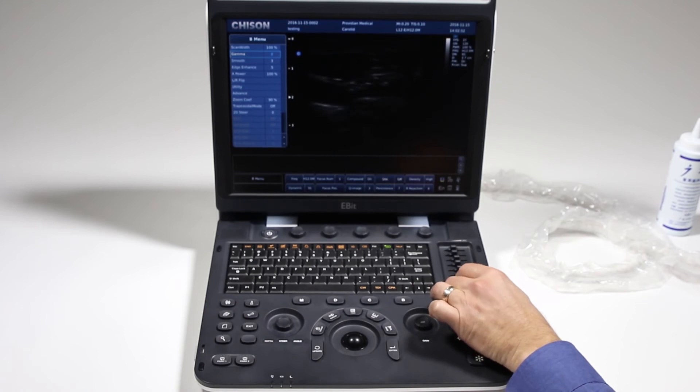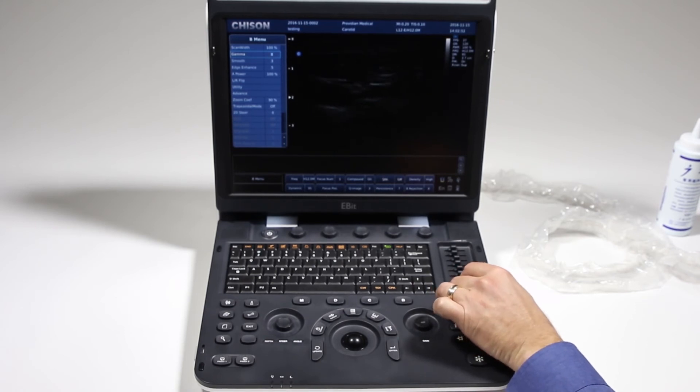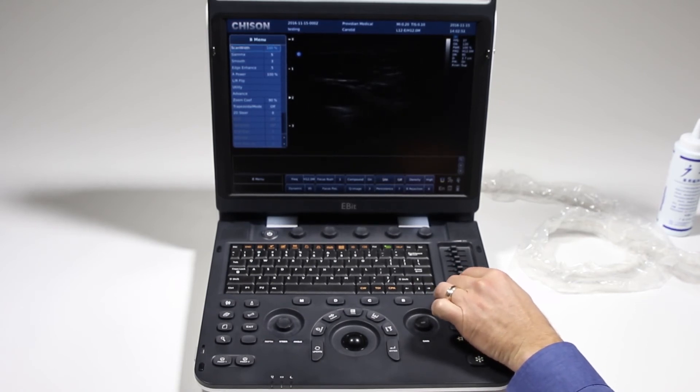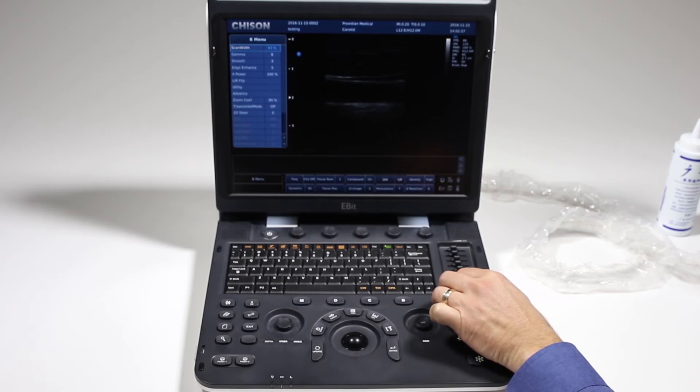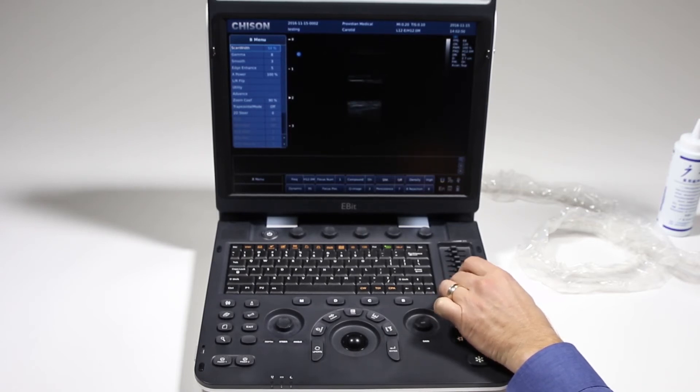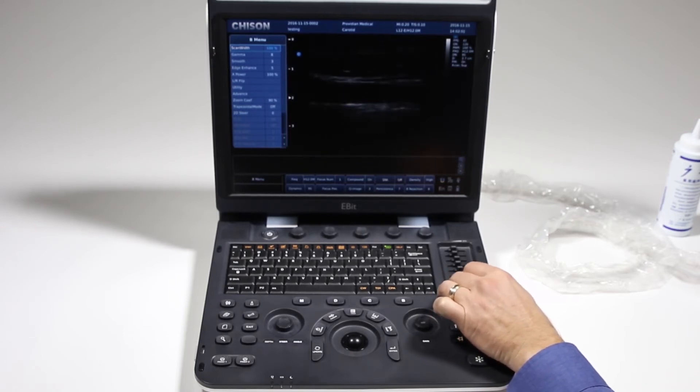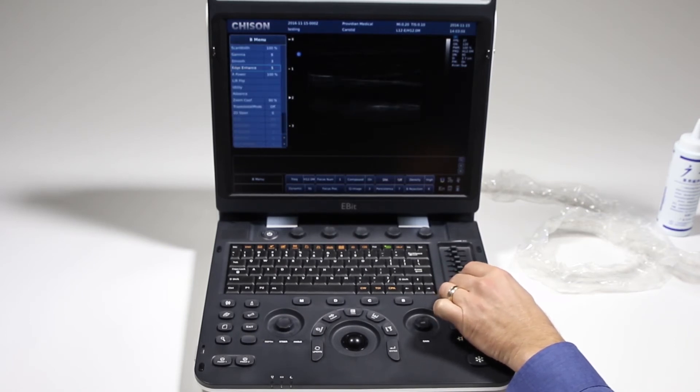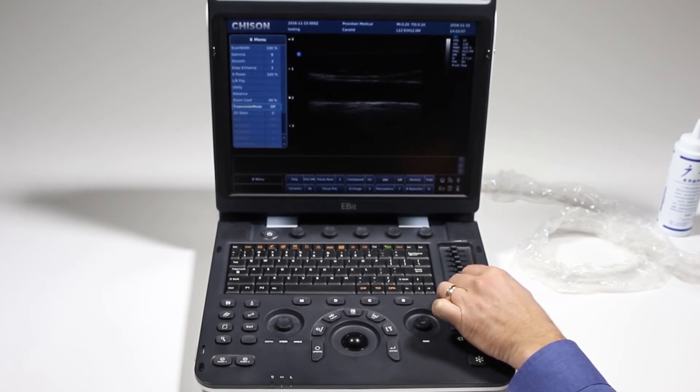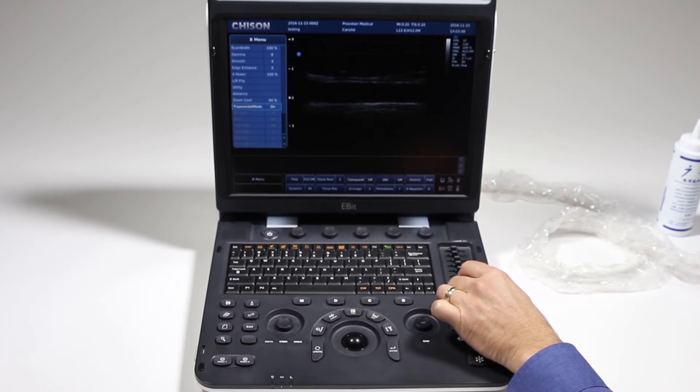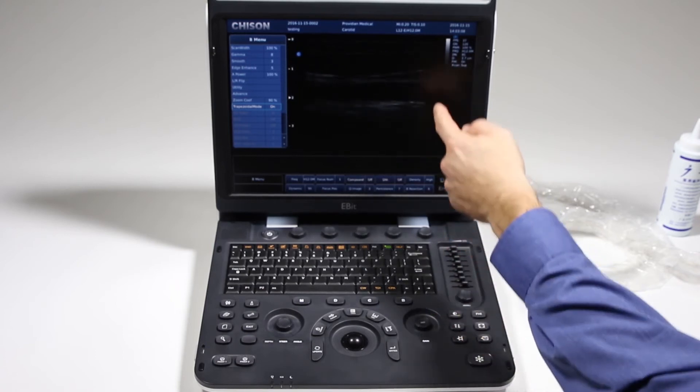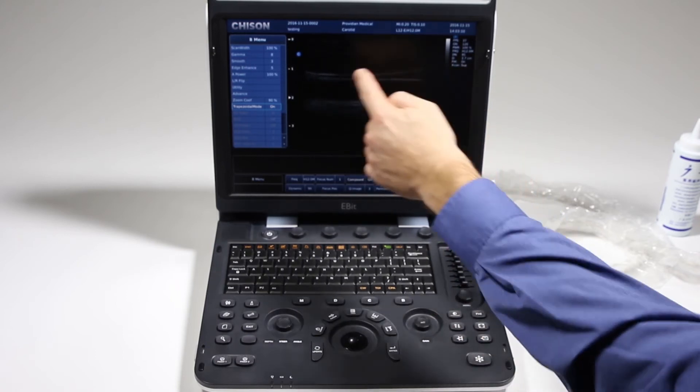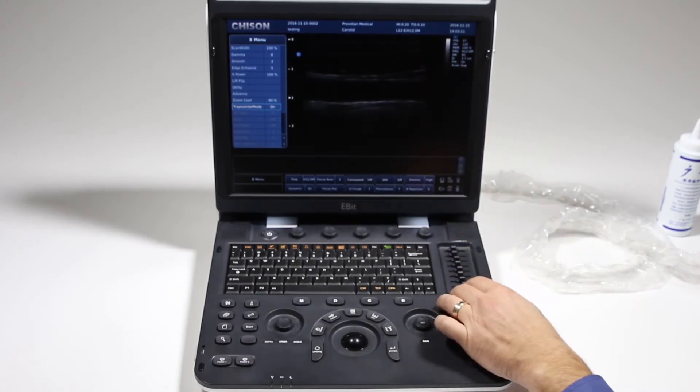The scan width, you can use that to increase your frame rate. We went straight up to 86 by decreasing the scan width. Trapezoidal mode, I'll give you a real quick show of what that looks like. I'll turn it on and it gives me a wider image down there.